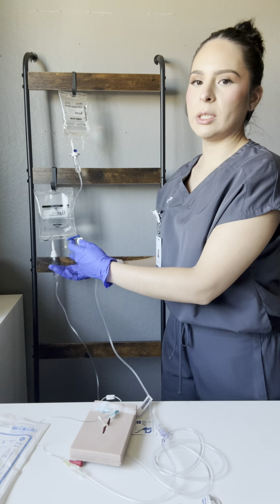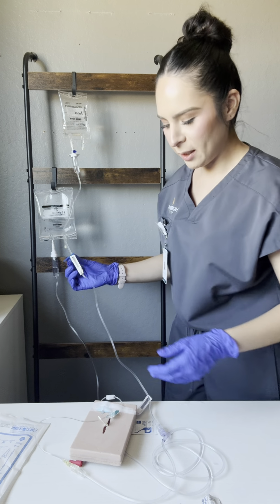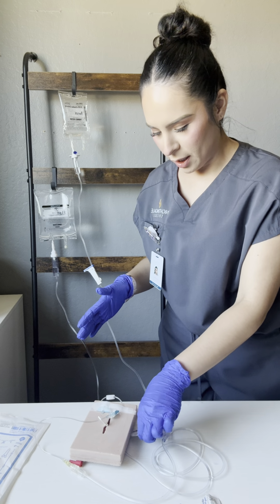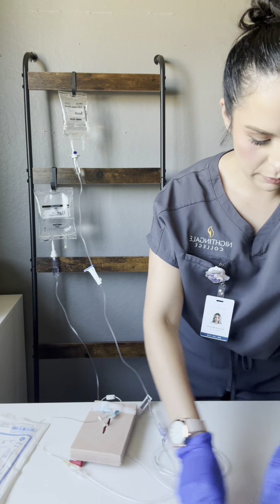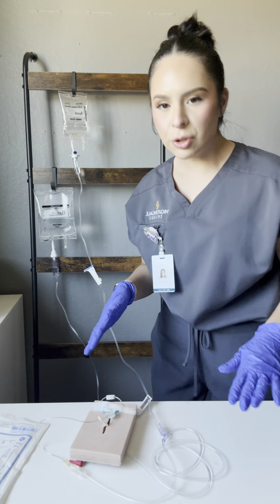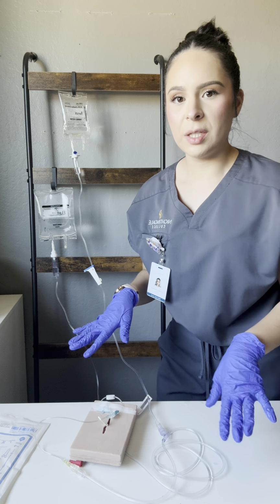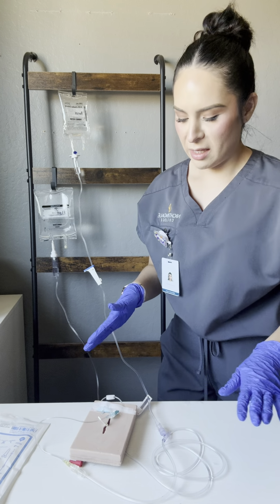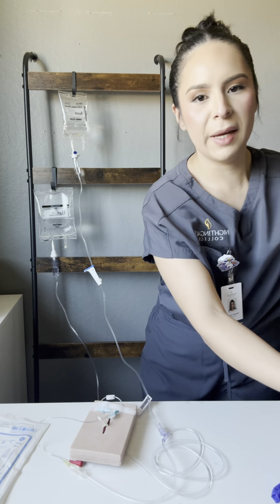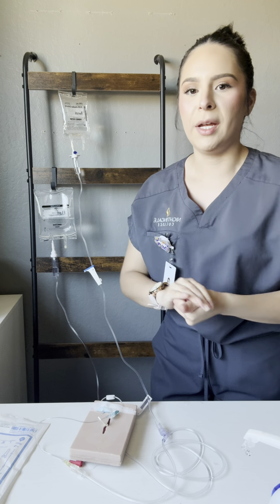Again, in the real world, I would let this run, but for this video's purposes, I'm going to close the line. I am going to want to discard of my trash, and then I'm going to want to check the IV site for any signs of infiltration, such as redness, swelling, any blanching of the skin or cold to touch. And then I'm going to remove my gloves, perform hand hygiene, and then document the procedure in the patient's chart.